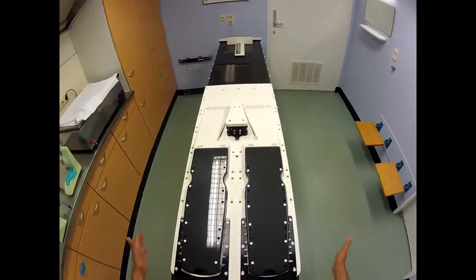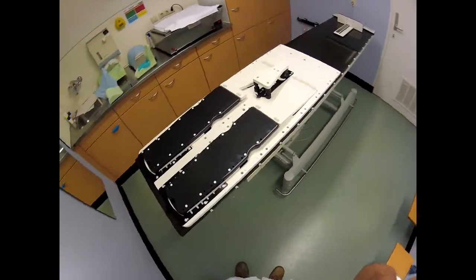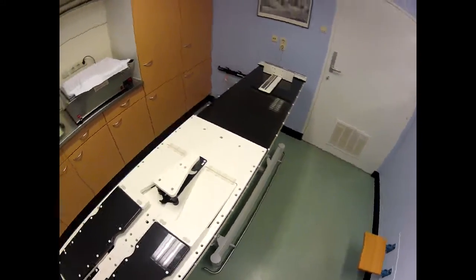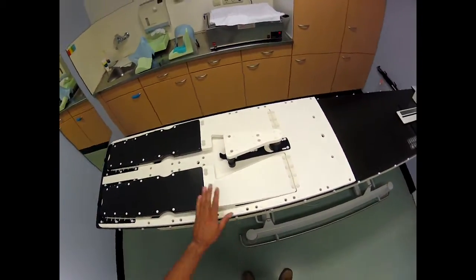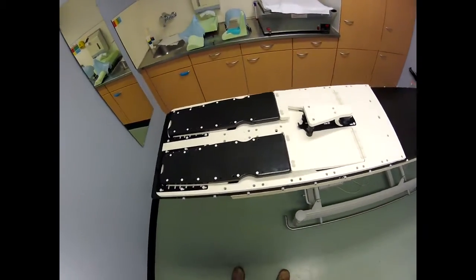Hi, well, look what we got here. You all know the movie I made for the positioning of a leg with the fabulous Nicole. I knew that this was around — it's called the Lex Ultra.